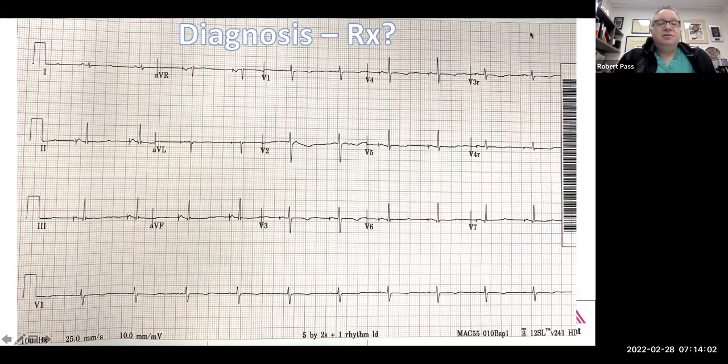Went to a different emergency department where an electrocardiogram demonstrated that the patient was having torsade and long little runs of polymorphic VT. So the doctor out there, who was affiliated with the hospital I was working with at the time, quickly faxed me a tracing.